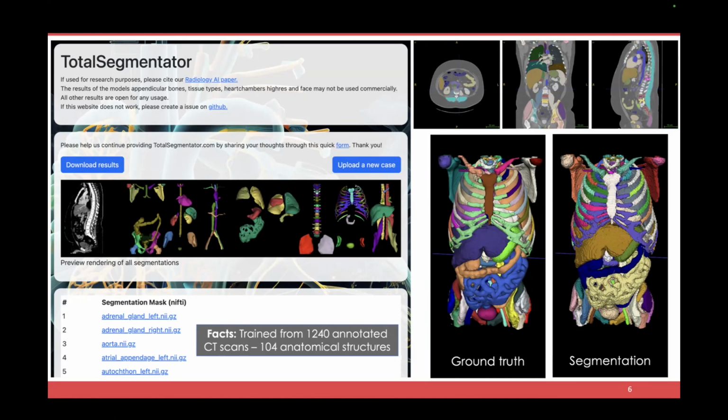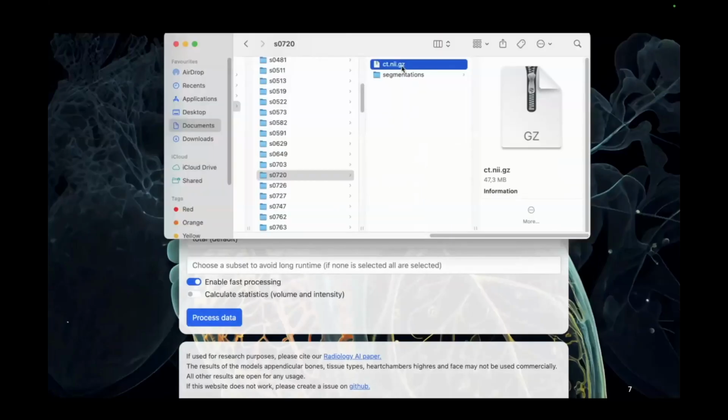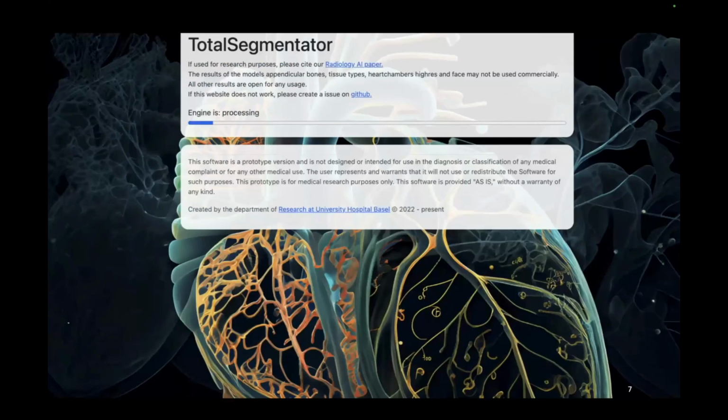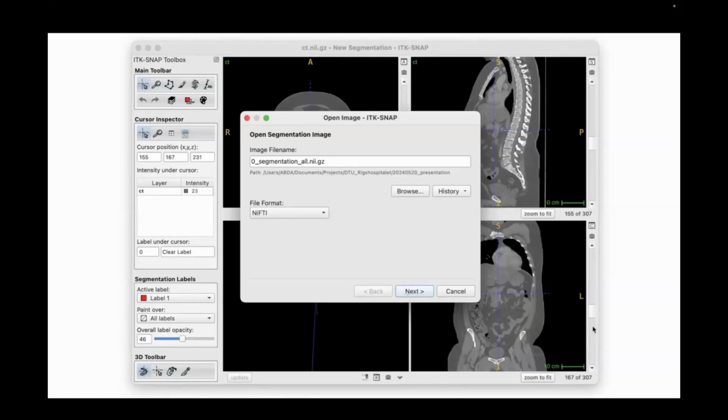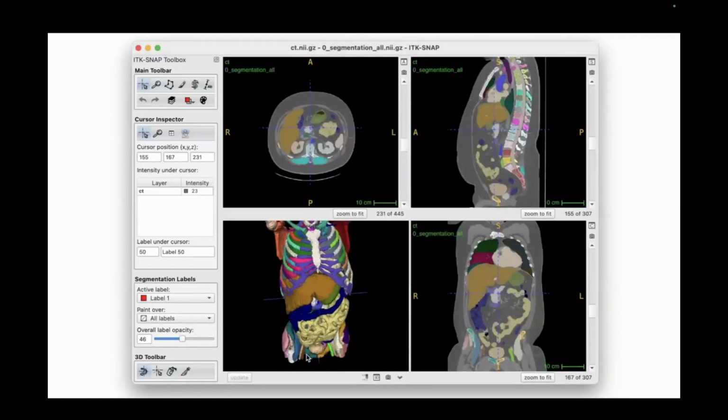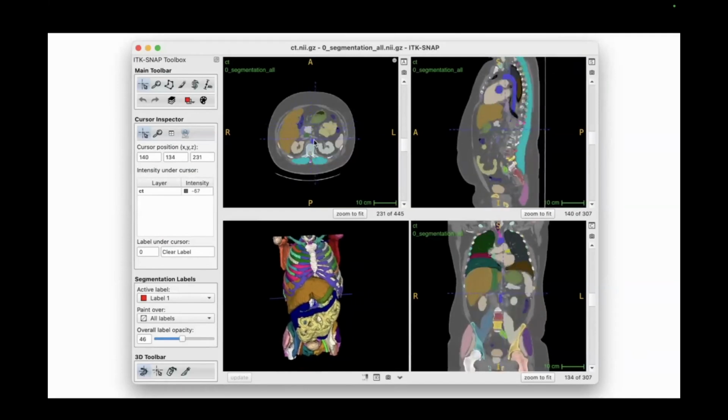So it's also a huge effort that has gone into this. If you should segment a person manually, it would take forever. But with this model, there's an online demo showing how it works, and I've just recorded a video of this. It's a sped-up video; it doesn't go this fast. Perhaps it takes 5 minutes, but after 5 minutes, you can download the result and load it into a visualization tool, and then you can see all the structures segmented out.